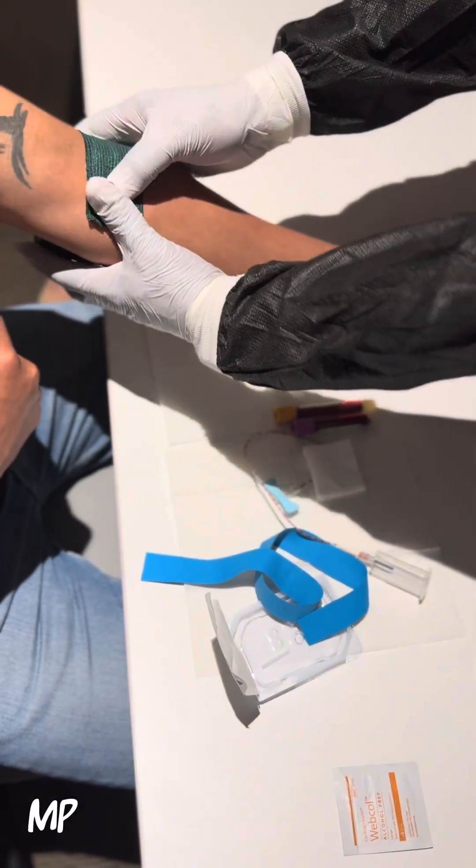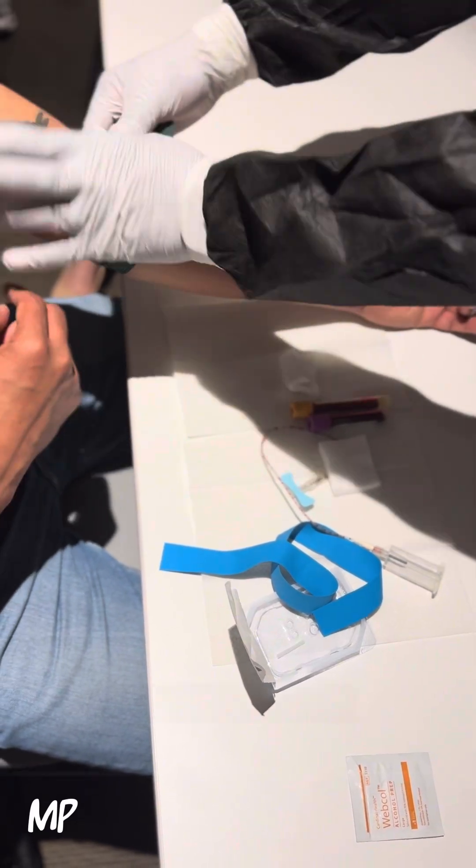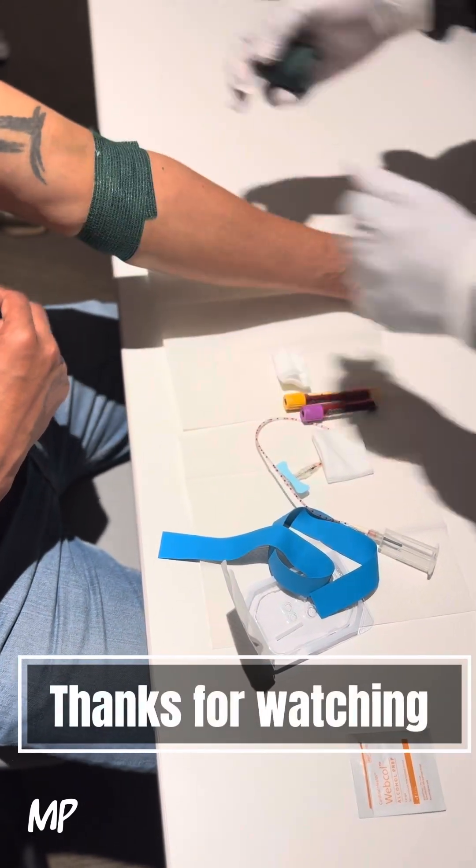Apply your Coflex bandage and then discharge your patient.